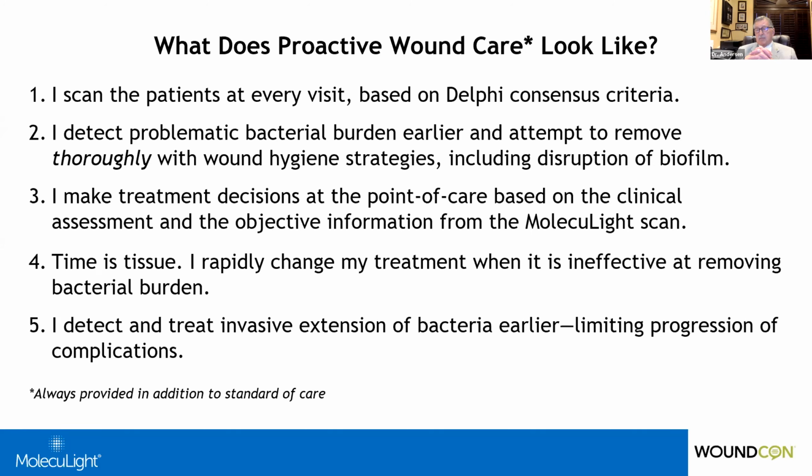So instead of a blind debridement, we can make sure that we're debriding that part of the wound to the level that we can get rid of the bacteria. So it helps us make decisions on the go. The scan itself takes very little time and it does not really impede the flow of patients in our clinic.